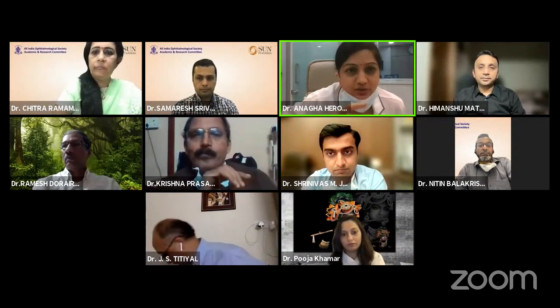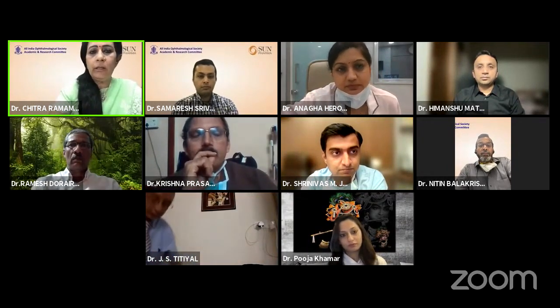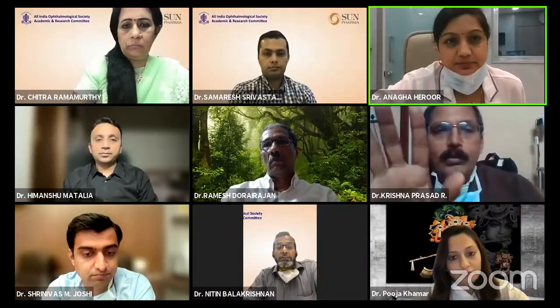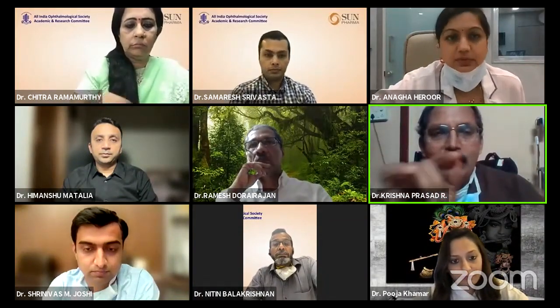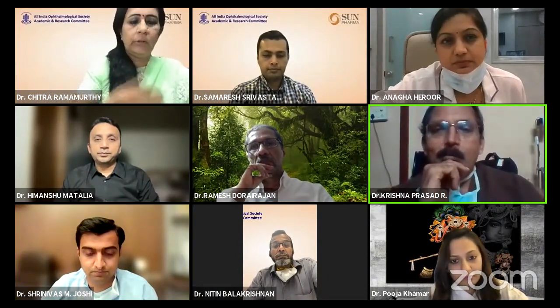You're saying for silicone oil filled eyes, right? Yes. Even in optical biometer, you can feed in the silicone oil mode. But it's a mature cataract, and that is the point. So the optical biometry is not possible because of the maturity of the cataract. So you can reset the velocity, and that would be probably the best bet compared to all the options available.